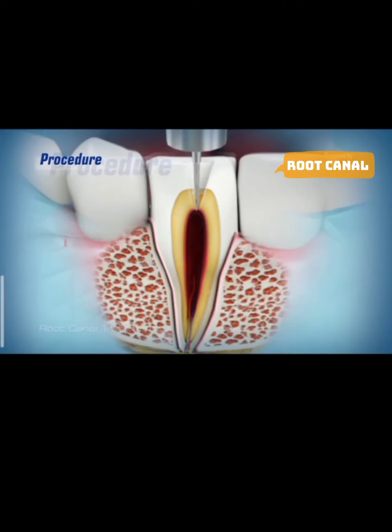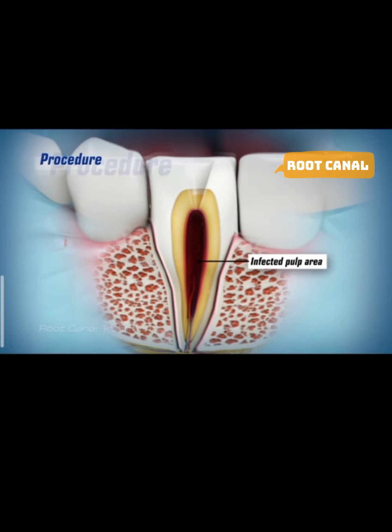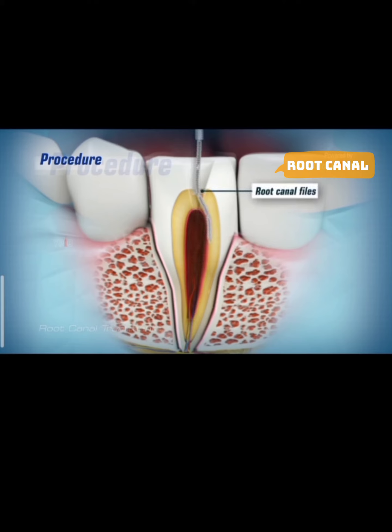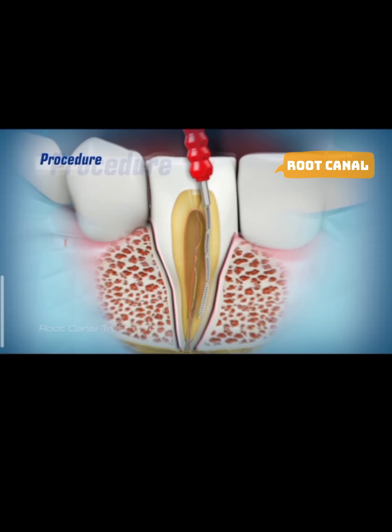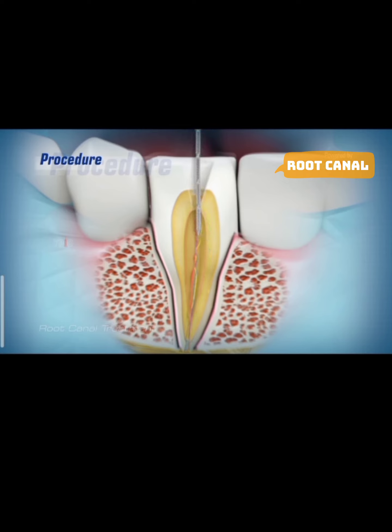In the tooth, to reach the infected pulp area, the infected contents of the pulp chamber are carefully removed. Using root canal files, a series of root canal files of increasing diameter are subsequently placed into the access hole and worked down the full length of the tooth to scrape and scrub the sides of the root canals.